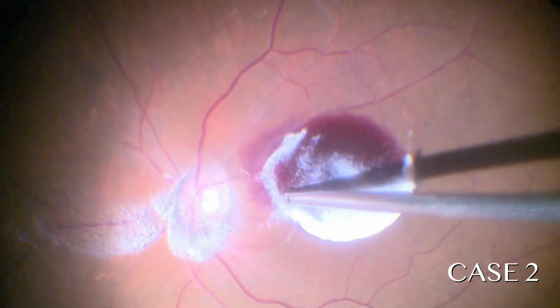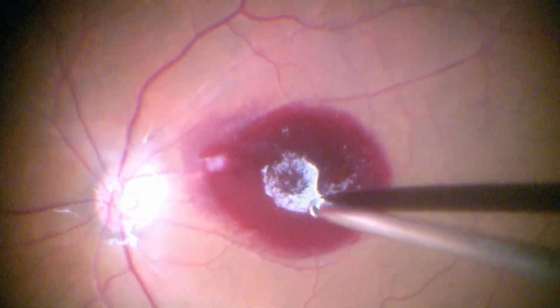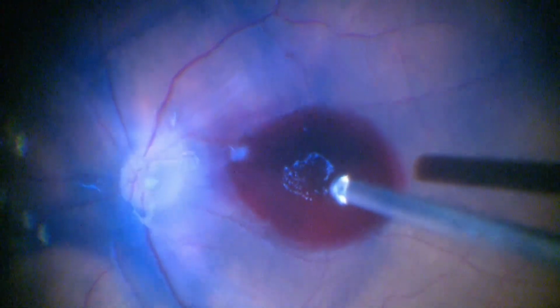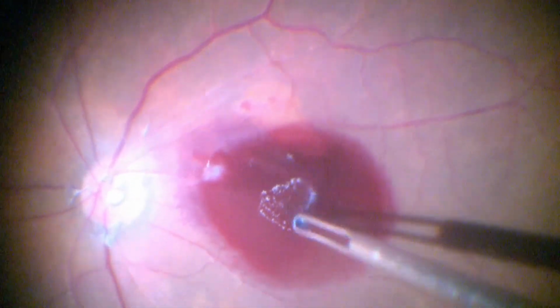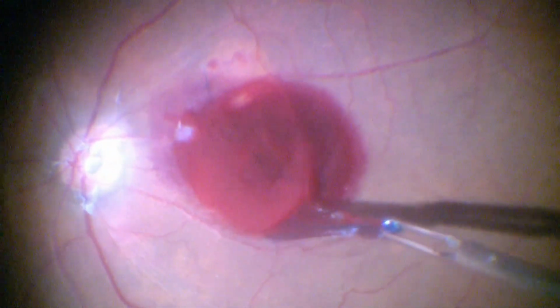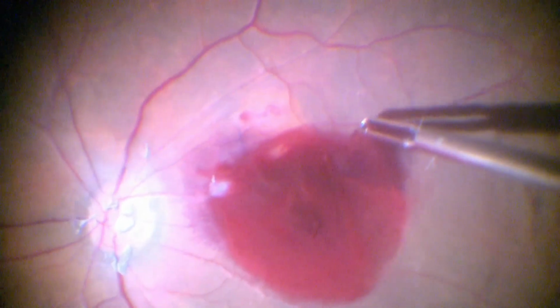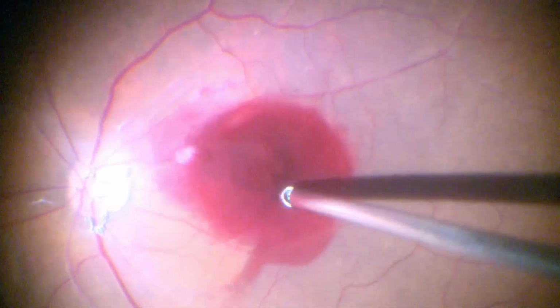In this case, PVD induction was carried out after staining with triamcinolone. However, hyaloid removal did not expose the trapped hemorrhage. At this stage, brilliant blue dye was used to stain the ILM and then remove it tangentially using a forceps. The exposed blood was then gradually aspirated.